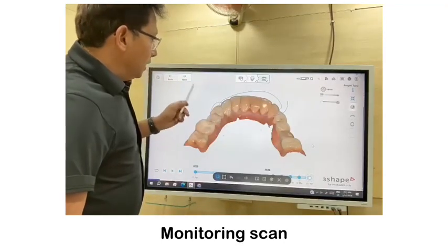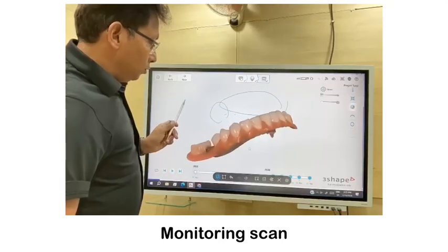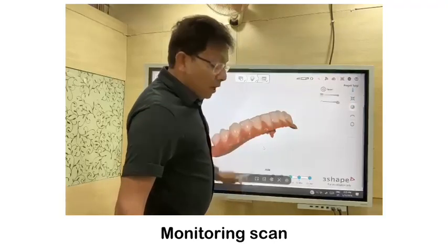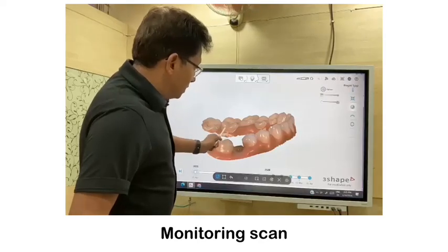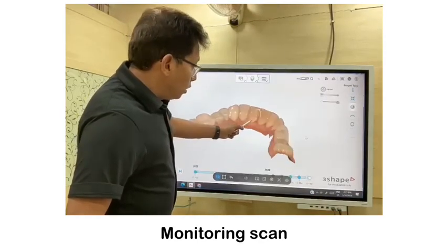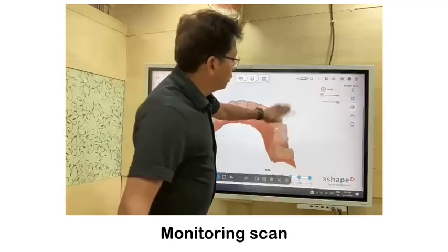Polishable, polished, and flossing can be done. This is the original, and every tooth is rebuilt naturally and without grinding them. Only those teeth which had crowns or onlays, we changed them. Otherwise, natural teeth were rebuilt with composite. So this is a combination of composite. Here you can see the canine. It is composite. But we have to consider many factors while rebuilding the occlusion.